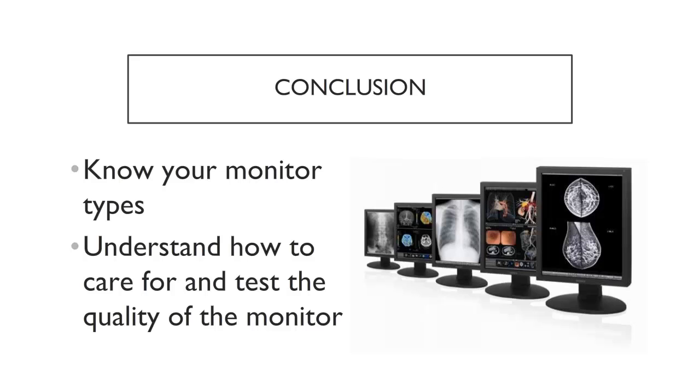Digital display of images requires standardization and accuracy. As stated earlier, the weakest link in viewing medical images can be the display monitor. Know the advantages and disadvantages of monitors used in medical imaging. Know the standards for viewing different types of images on the correct monitor. And be familiar with tools to properly maintain and test the quality controls of monitors.